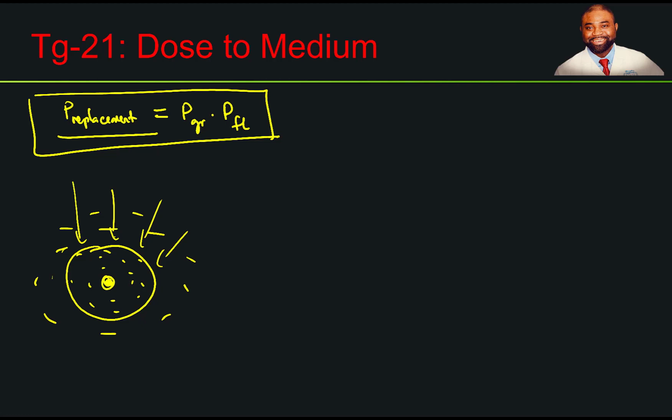And really, the magnitude of the gradient correction factor depends on the dose gradient at the point of measurement. More often than not, per updated TG-51, the gradient correction factor is actually taken into consideration by shifting the actual point of measurement, or by considering the effective point of measurement.